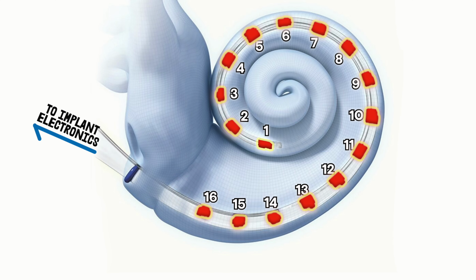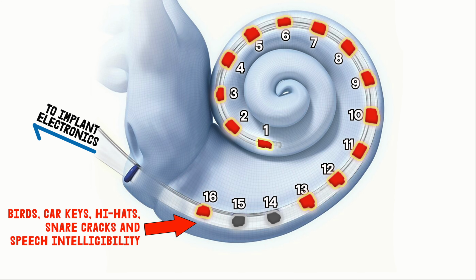And that brings me to my next experiment. Do you see where I'm going with all of this? What if instead of turning off 15 and 16, we tried turning off 14 and 15, or maybe 13 and 14, or maybe just 14 or 15? Would that push those lower frequencies down in pitch like my experimental map did, while placing those higher frequencies that I've been missing back up into their appropriate location on the outside of my cochlea, where those sizzling S sounds make my brain so happy? I don't know. Makes sense to me.